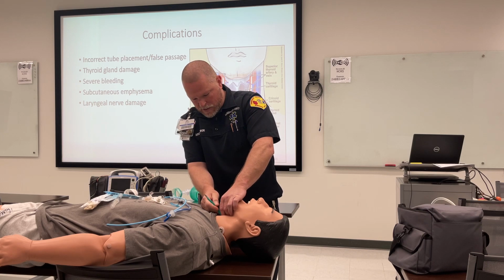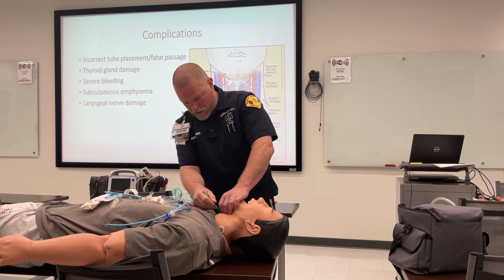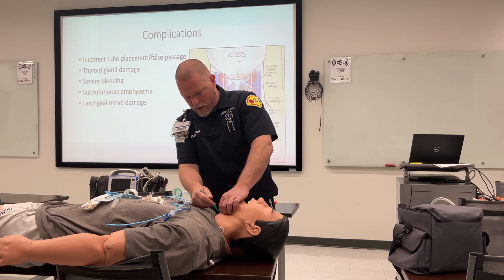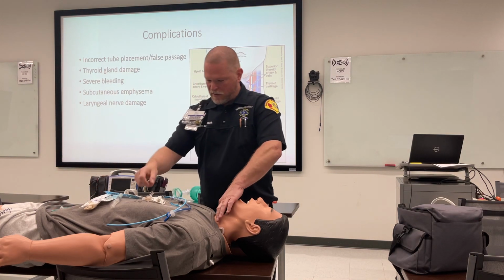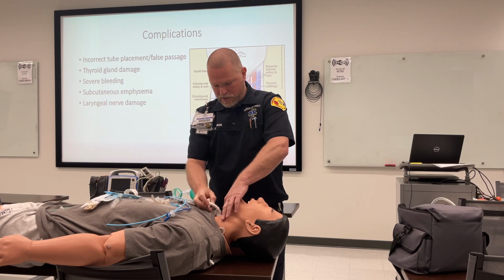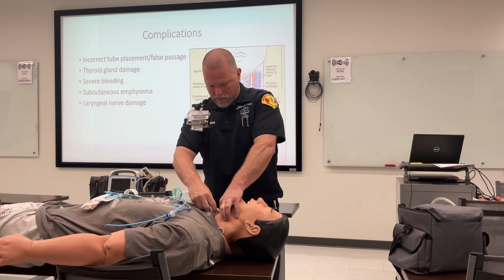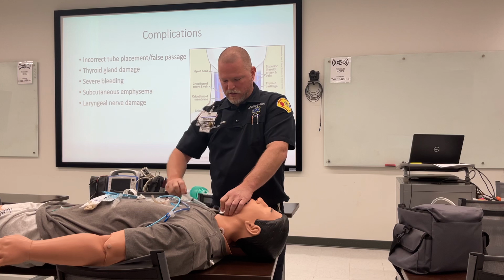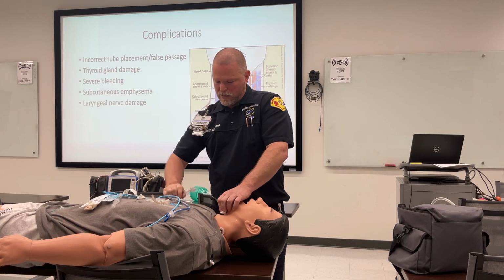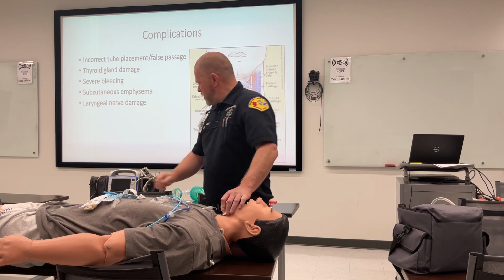You use the back of it, you spread it apart where you can get to your membrane, and then you go in and you make a 1/2 inch stabbing incision on each side, and then I'm using my finger. This would be deposited in my sharps container. I have my device. I follow it down the hole. Inserting it. Pull your introducer out. Inflate your tube. You want to put the tube in place.